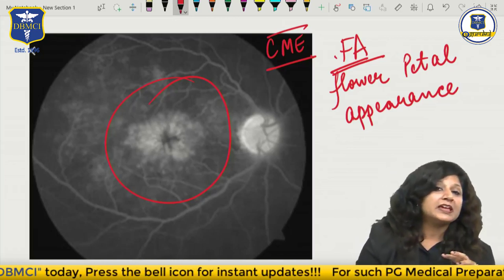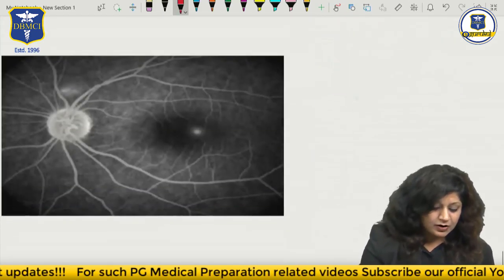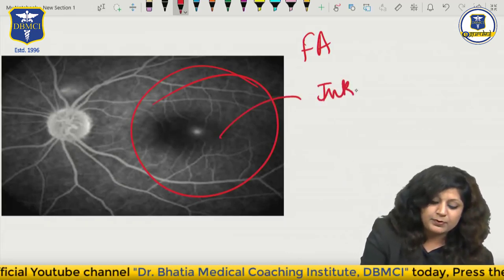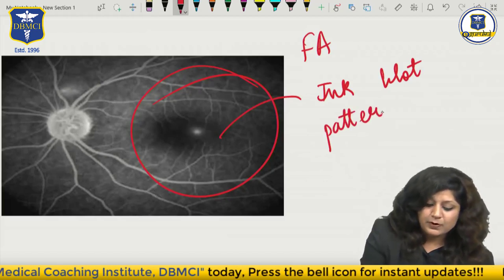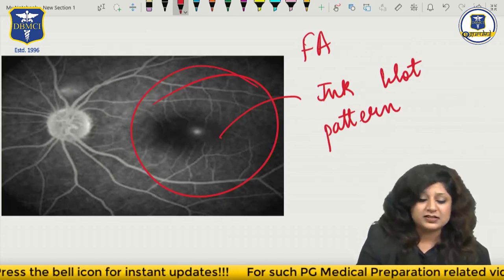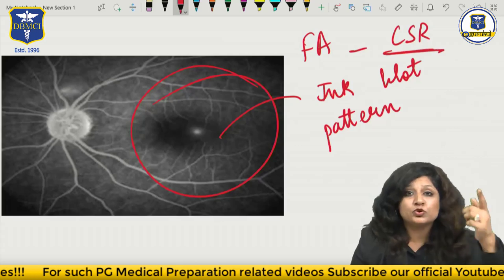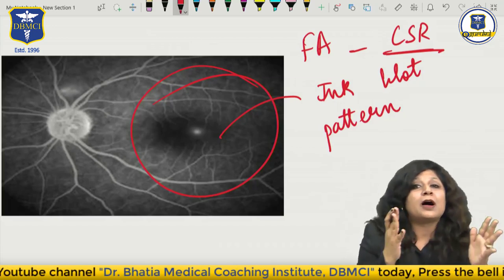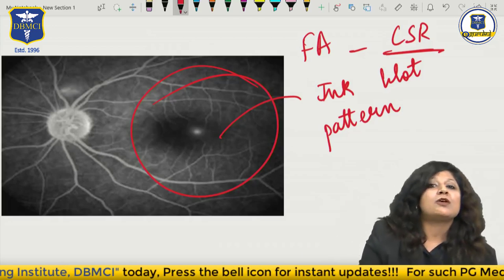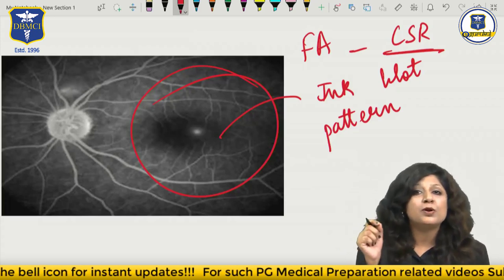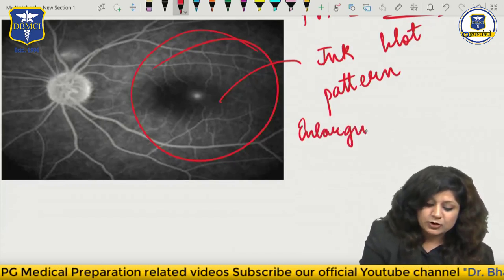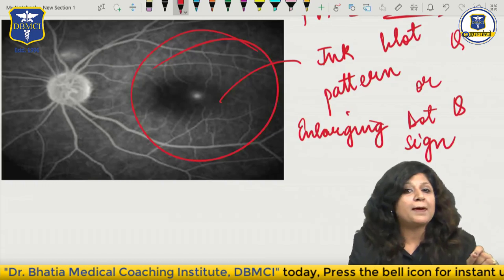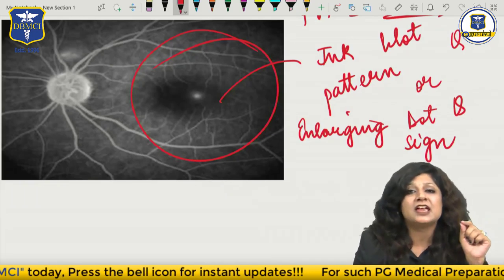Now see this one - this is another FFA showing a large blot. This is called the ink blot pattern. While you are getting this ink blot pattern, this is again found in CSR. It can be a mushroom pattern or an ink blot pattern. Due to the detachment of neurosensory retina, more amount of fluid means more amount of dye, and more amount of dye means a larger blot. This is also called the enlarging dot sign. So ink blot pattern or the enlarging dot sign is again a feature of CSR.